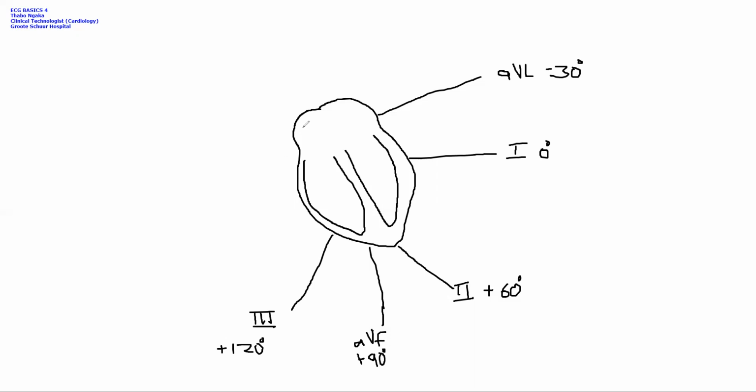Plus. And then we have our AVR at minus 150. Great stuff.